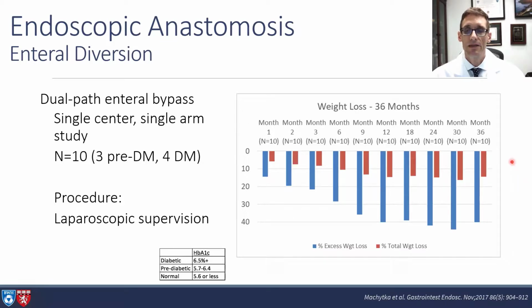It also has substantial weight loss, about 14% total weight loss at that 3-year mark. So this device is now really being performed or utilized laparoscopically, but they do have other endoscopic iterations on the way.